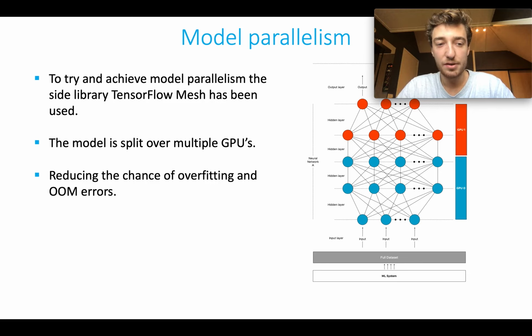But if you're going to use high dimensions of images, because there are cone beam CT scans out there that can create, for example, 1024 by 1024 image sizes, the amount of parameters that will be created are enormous, and no GPU can handle this amount of memory.